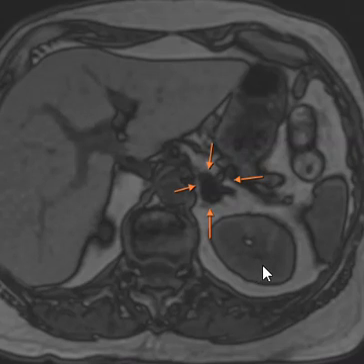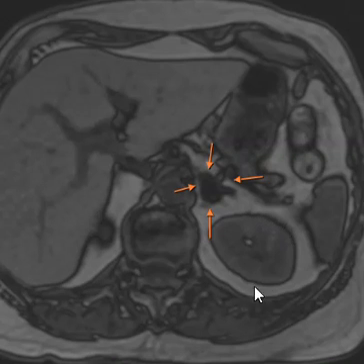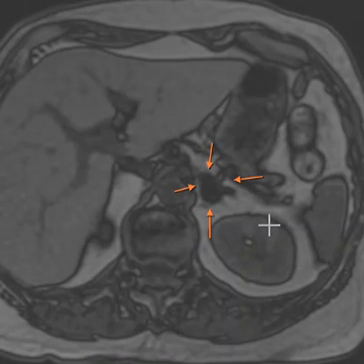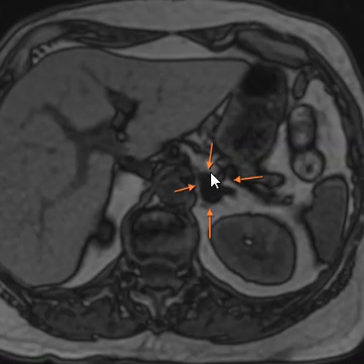Here is the out-of-phase image. We can see this sharp line around the outside — these are typical chemical shift artifacts for out-of-phase images — and we can see this is uniformly dark, so there is signal dropout.